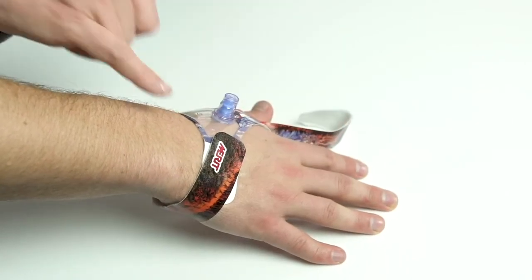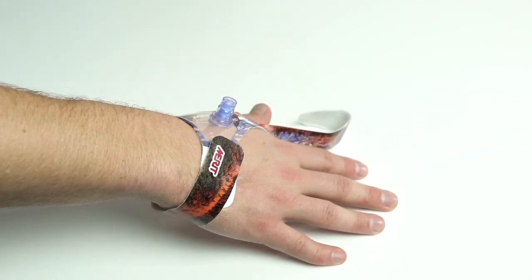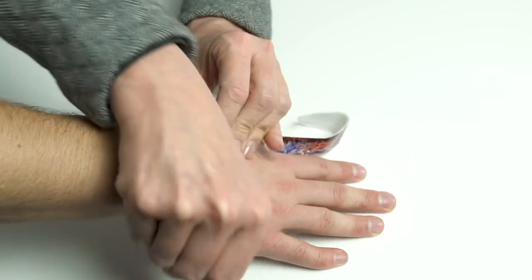What we want to prevent is any kind of gapping here on each side of the backer plate, which you see that I just did. Now I'm going to show you what we've seen a few times.